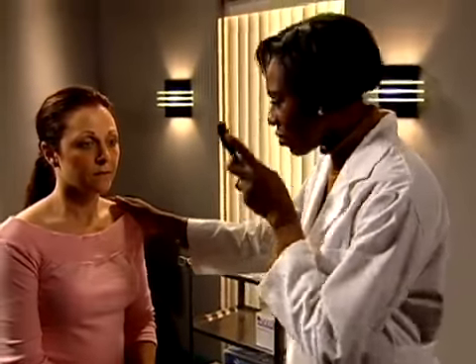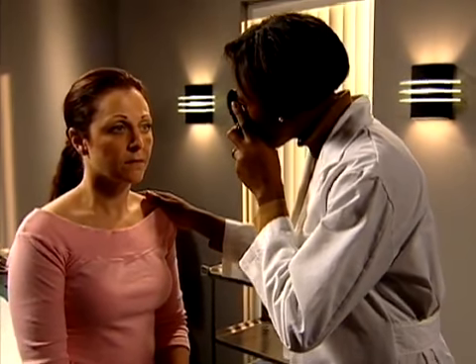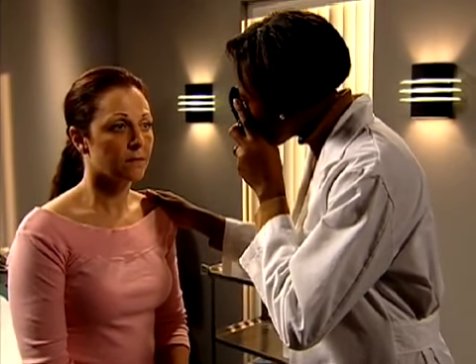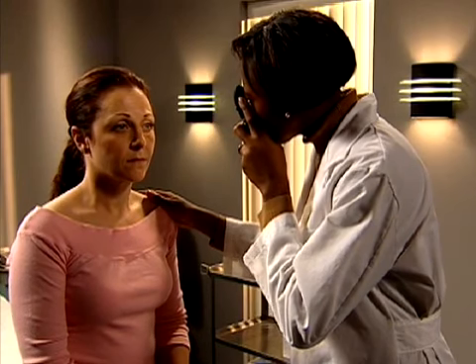With the ophthalmoscope in your left hand and its lens set to 0, use your left eye to examine the patient's left eye, starting with the red reflex. For stability, place your right hand on the patient's forehead or left shoulder. Then direct the light at the pupil from 30 centimeters away. As the light hits the retina, you should see a red reflex with no black densities.